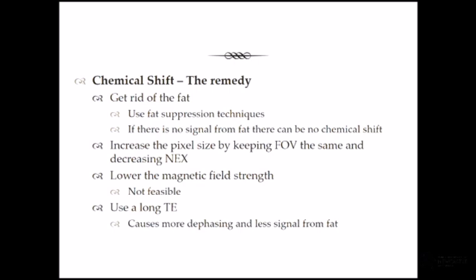So like all things, when you get a microfracture, you get increased water. So if we suppress the signal from fat when we're doing bone imaging, it's really good for looking at edema. So we can see a small bone bruise. So that's kind of how we use our fat suppression technique. We also use it a lot when we're doing breast imaging because we're interested in the breast parenchyma and not the surrounding signal from fat.